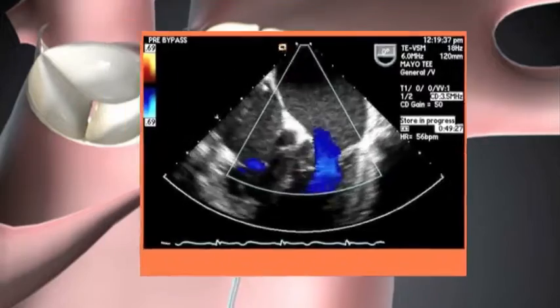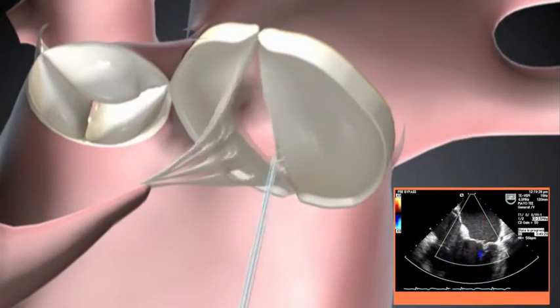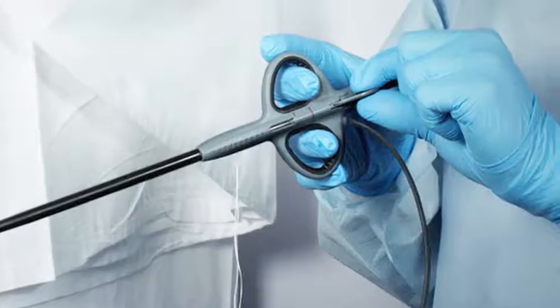Live Echo allows the surgeon to adjust the suture to optimize the valve function. The DS-1000 is a simple, elegant solution. It facilitates a minimally invasive alternative and ultimately leads to better patient outcomes.